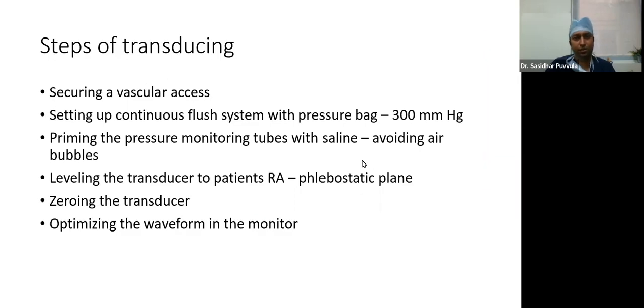So what are the steps of transducing? Obviously, first we need to secure a vascular access. We need to set up a continuous flush system with a pressure bag. So how much pressure is needed?